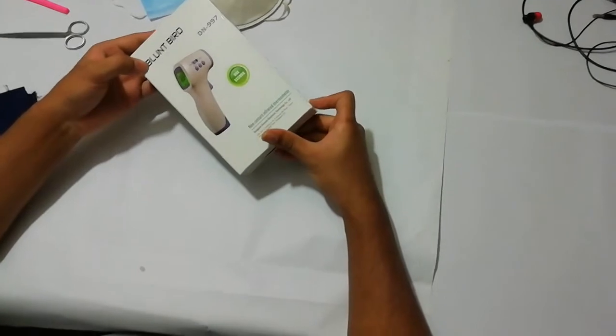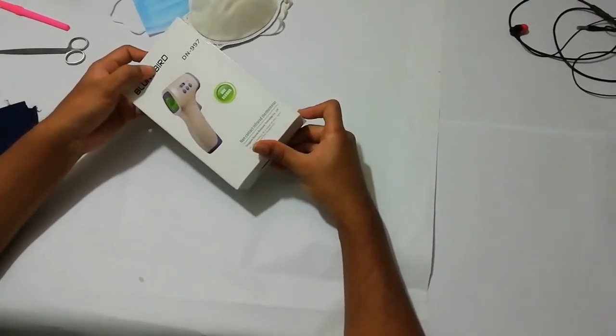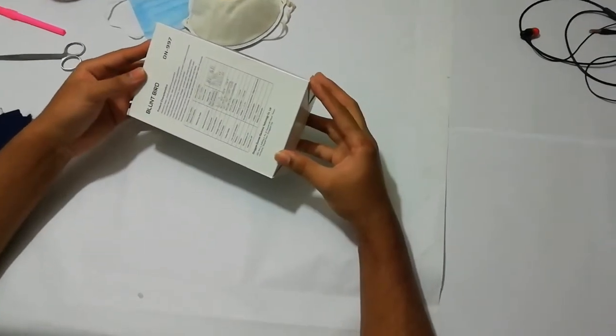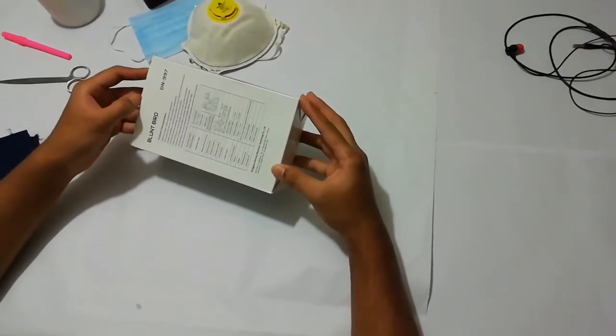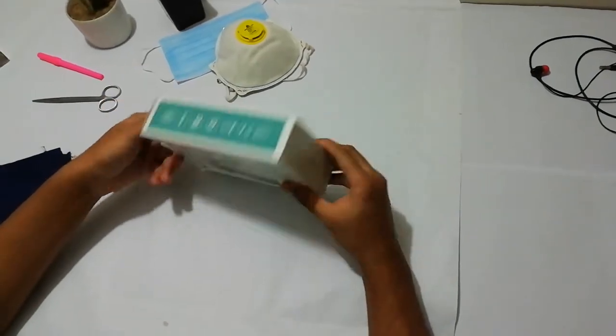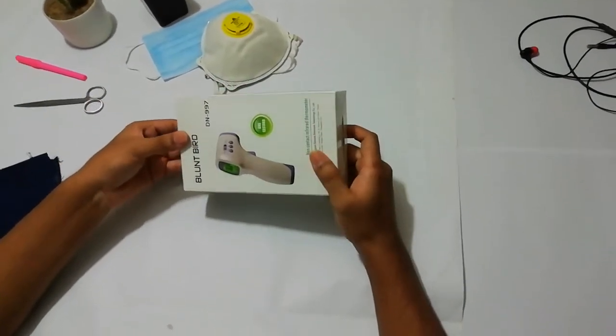First of all, we see the logo. The Blunt B-I-R-O D-N-997. It costs TK-1300 in Bangladesh Taka, and it is only available in Dara's online shop. Let's unbox it.